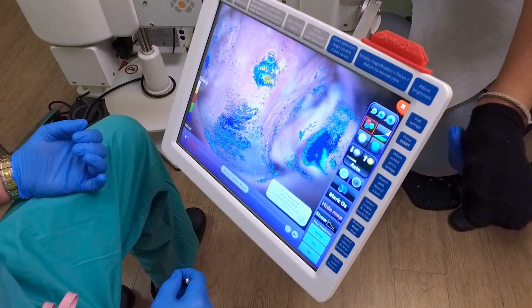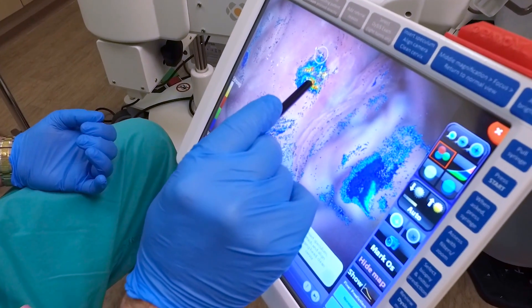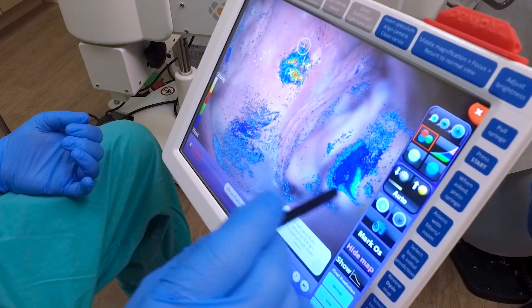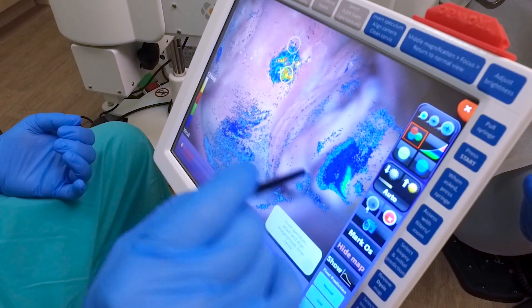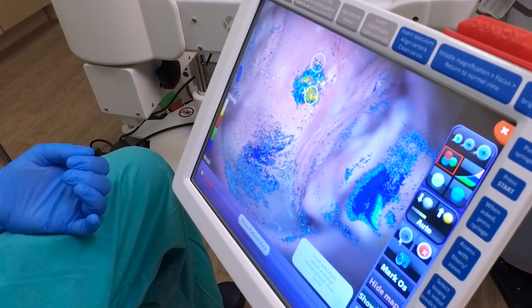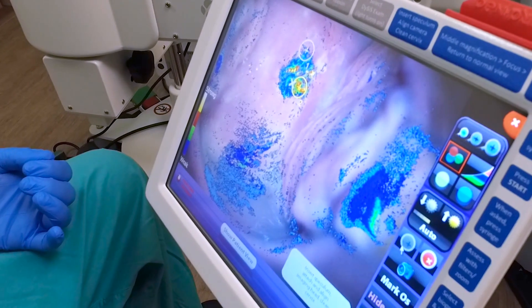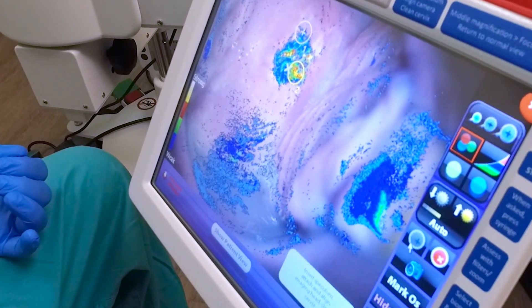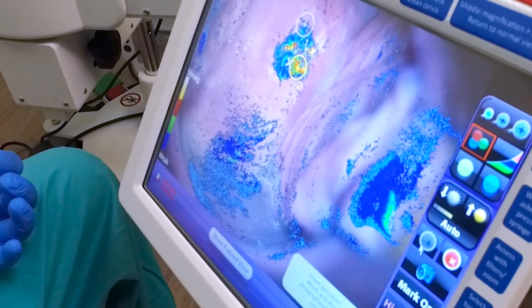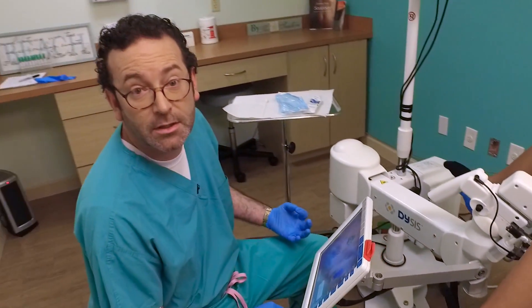The colors show us the areas that may be the worst. The computer looks and sees an area here that suggests may be abnormal. So that tells me I'm probably going to biopsy that spot. In so doing, we're able to tell which area is the most abnormal — which most likely caused your pap to be abnormal — and give you the most accurate diagnosis with the very least amount of invasion.